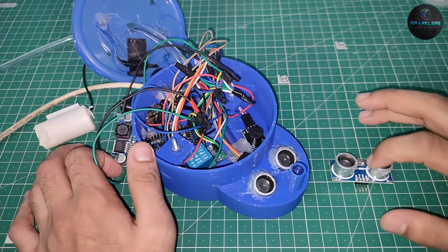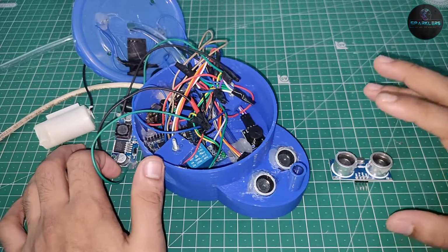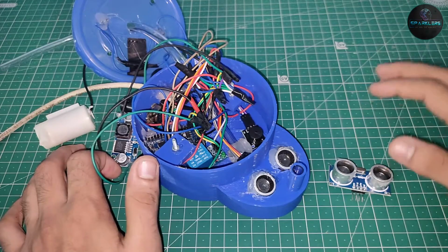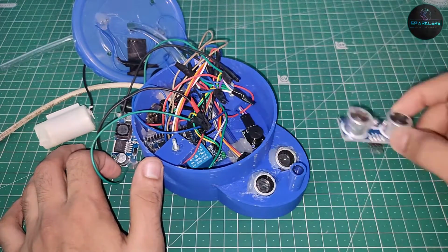So I have connected it to pin number 4 and 5 in Arduino, trigger to pin number 4, and the echo to pin number 5. So this is how you connect this thing with Arduino.